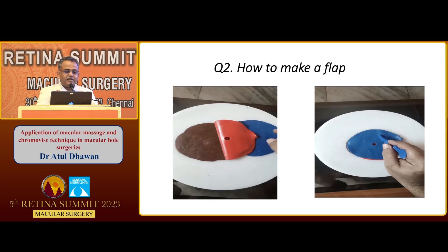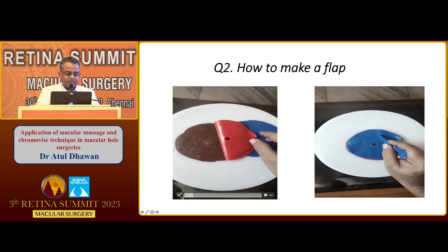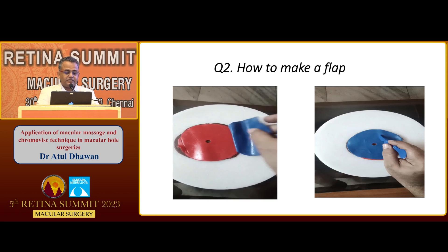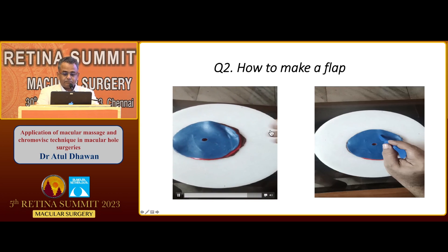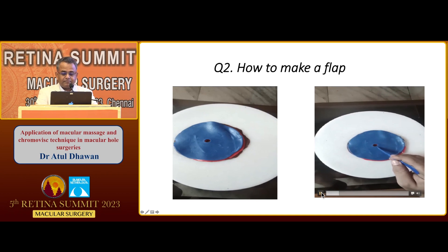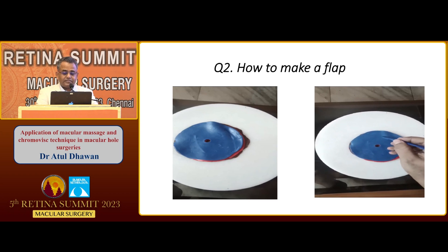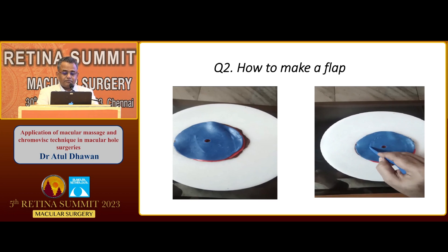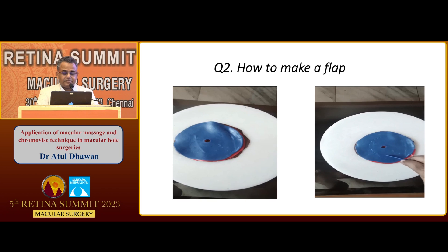The second question is how to make a good flap. The first video shows a small demonstration. There are three layers: RPE, neurosensory retina, and the ILM. To make a flap: make an imaginary line of 200 degrees, make a small cut circumferentially, and then join these cuts.